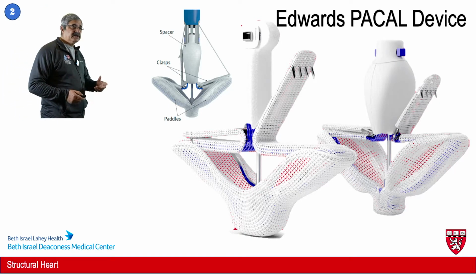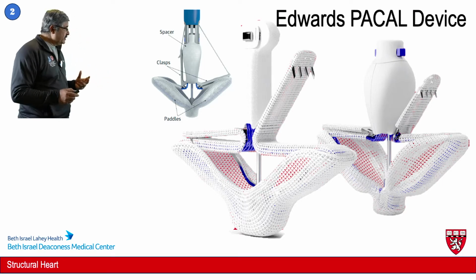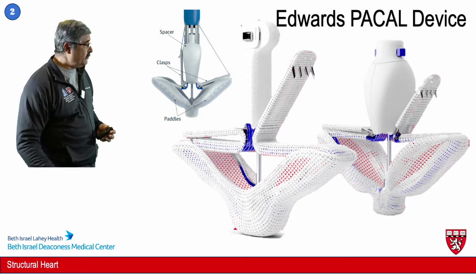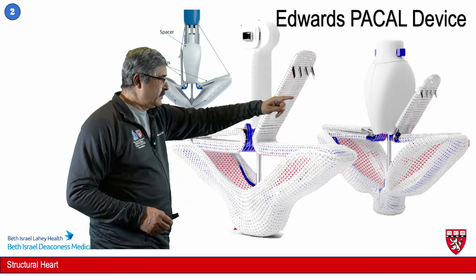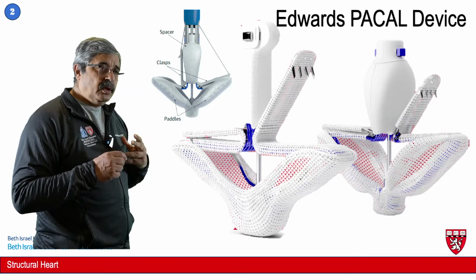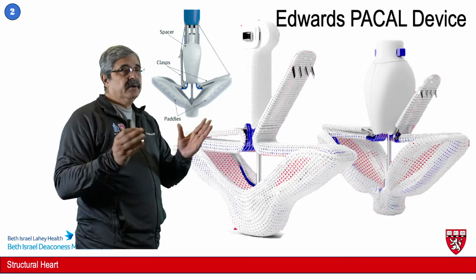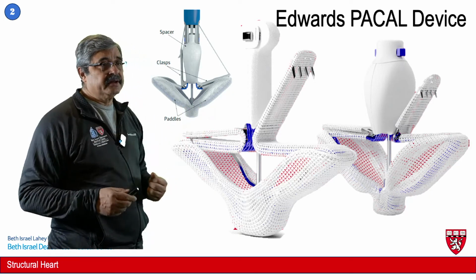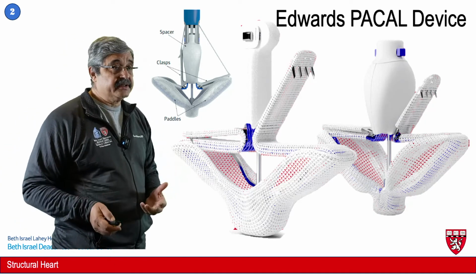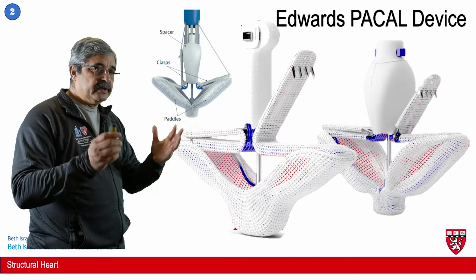The change in terminology, they call them clasps as opposed to grippers, and the arms are called paddles. The major difference is that they have a spacer in the middle, and that is the key difference, that this spacer, according to them, and as well as over here, gives them the ability to grasp the leaflets and not generate that much tension, reduce mitral regurgitation, but since it's not pulling on them that hard to bring them together, there's less tension. But these are all manufacturer claims, never been tested, but essentially the principles are the same of bringing the leaflets between the clasps and the paddles, closing them, and then finally closing it together.